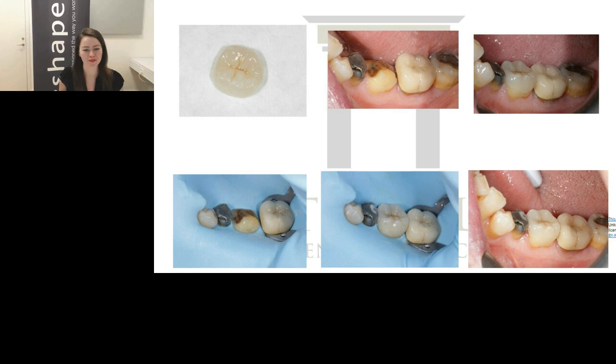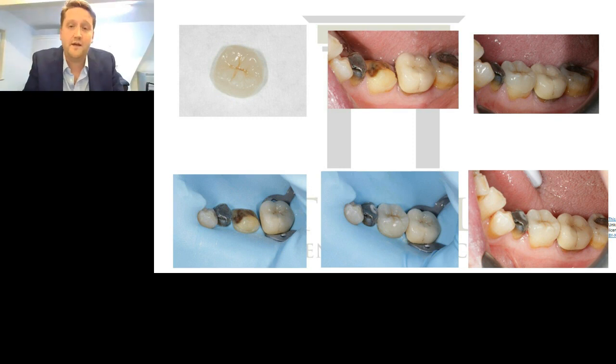Yeah, sorry. Yes, this was the final stained and glazed crown after milling. So the prep there, initial try-in, and then rubber dam and bonding. And I'll briefly go through the bonding protocol in this. Yeah, I wanted to do that, but the patient wouldn't let me.